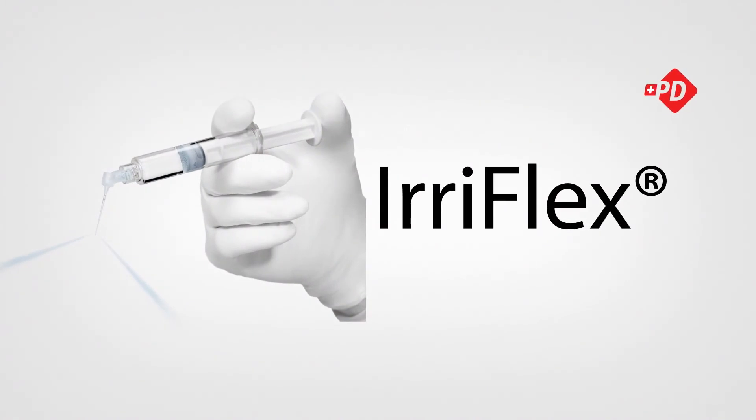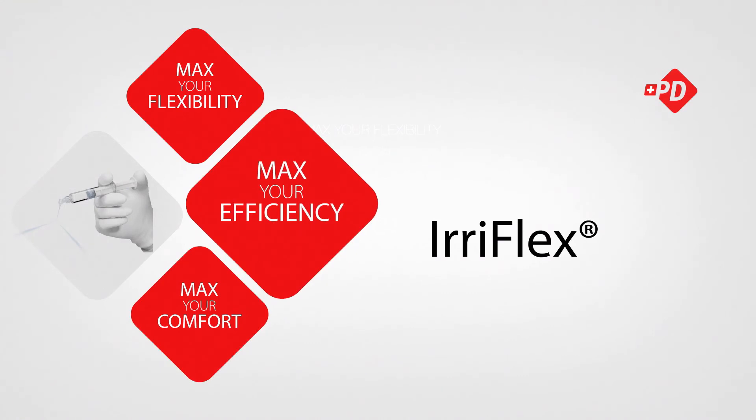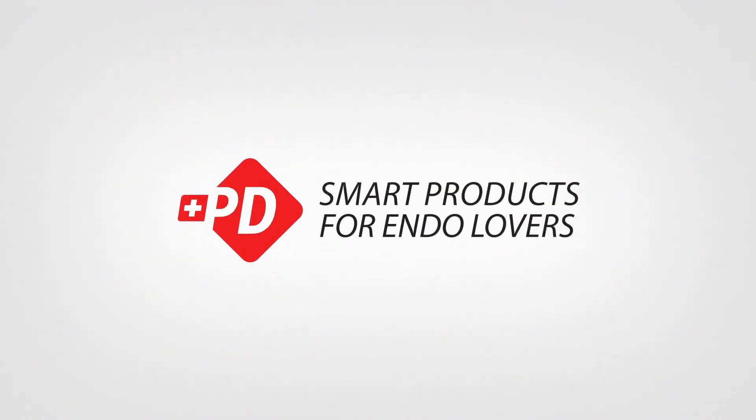IrriFlex improves cleaning efficacy and provides significant benefits over the use of conventional irrigation needles. A new standard is born. Visit us at pd-irriflex.com.